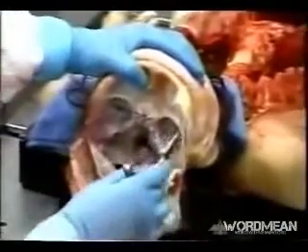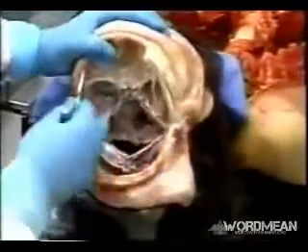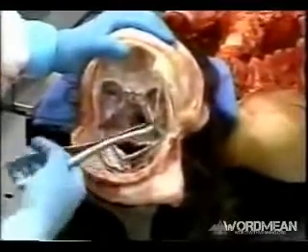The skull on the inside is lined by a tough membrane, the dura mater. In order for us to be able to visualize if there's any fractures, that membrane needs to be peeled away from the underlying bone. So that's what the assistant is doing now.